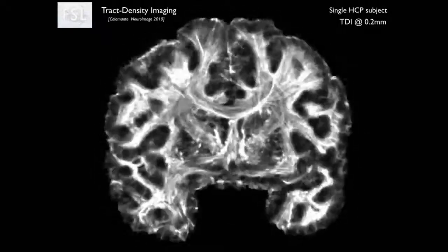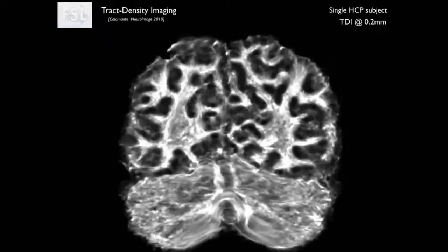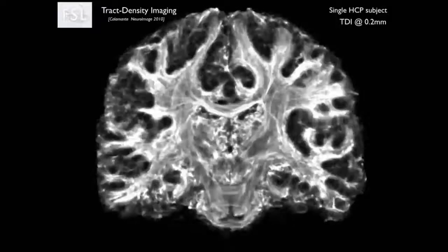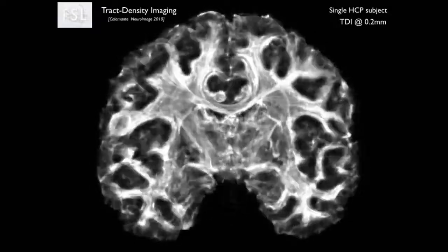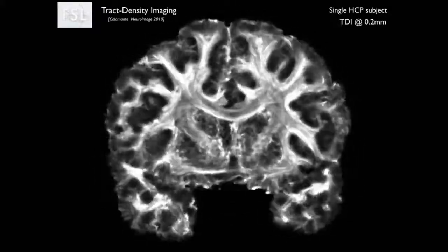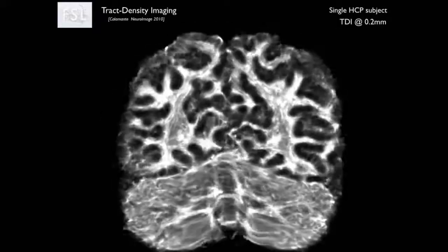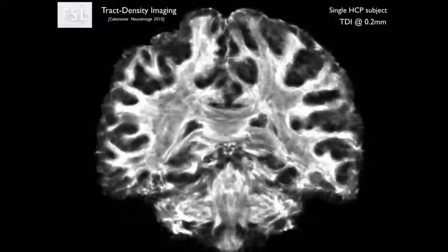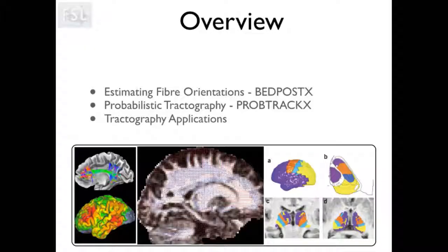So you see that basically what is passing through here, this is a movie created by Sajib Abdi in Oxford, and what we're showing you here is that at the resolution of 200 microns, so sub-millimeter resolution, you can start seeing the white matter fibers projecting coming out of a corpus callosum, for example, right? So you do super resolution starting from your acquisition, which was done at millimeter base resolution. We're going to talk about this a little bit later.